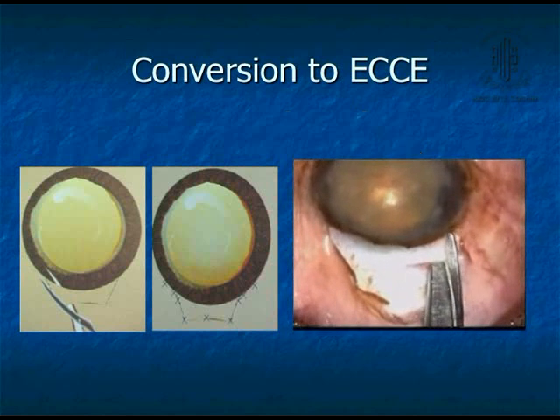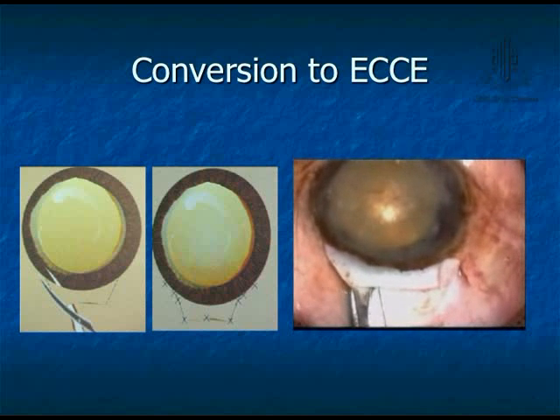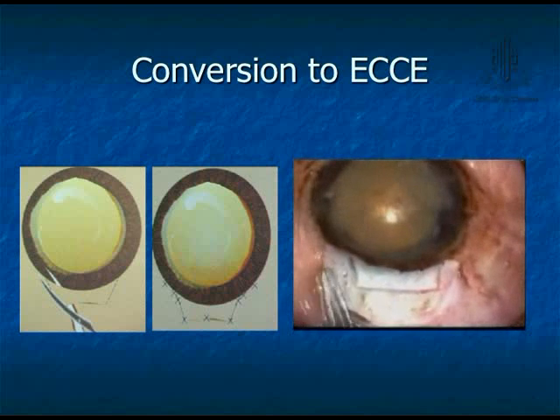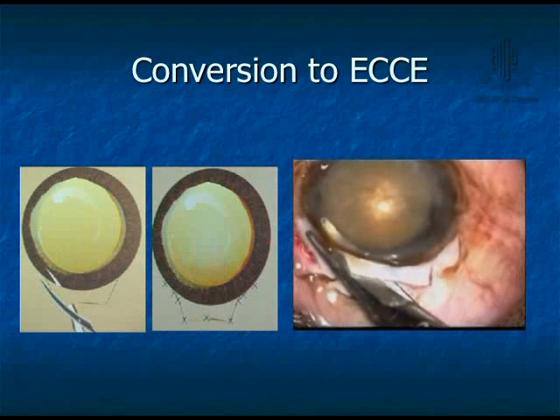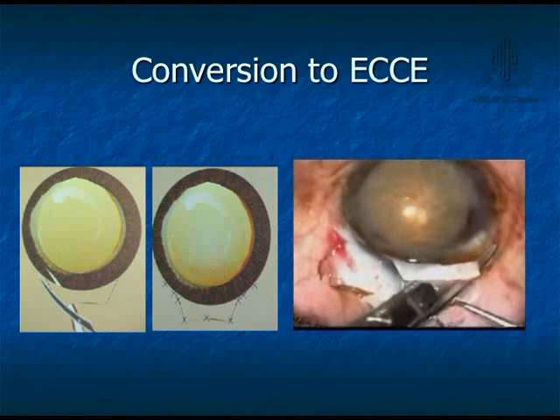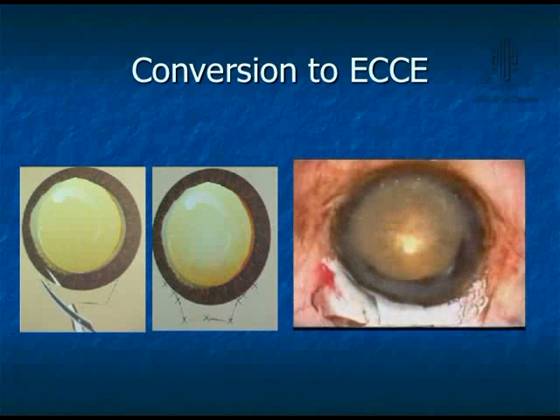Now here the nucleus is stuck and the inner lip has to be opened up, and here the surgeon is cutting both sides of the tunnel. It's not essential. If you feel that you can only cut on one side, it should be enough, because suturing is a very tricky affair, and this is a very important step wherein the outer tunnel is merged with the inner lip. This has to be done. If you don't do this step, you're still back to the same point.